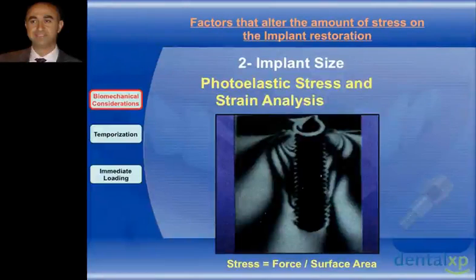concept that we don't really need to use long implants whenever there's bone available, because whenever you're just placing longer implants because you have more bone, you're actually killing living tissue. You're creating a dead space itself. And since from the literature and the studies, this stress and strain photoelastic analysis shows us that after 9 to 10 millimeters we don't have any loads, so why place longer implants and create more dead space than living tissue?